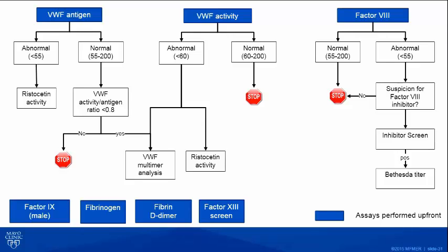So as you mentioned, we offer this as a limited bleeding panel because we do not include the platelet functional assays, because those have to be done within 4 hours. So that's essentially what I have for the screening assays.